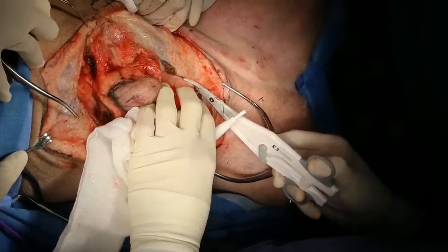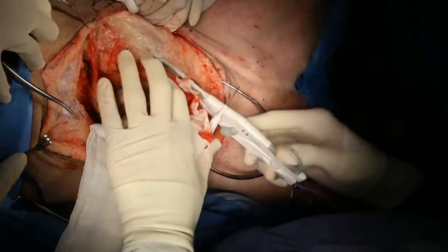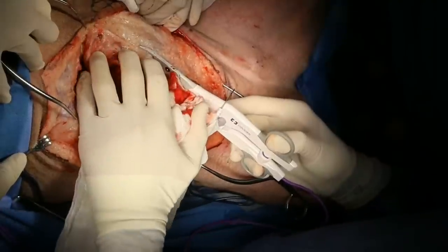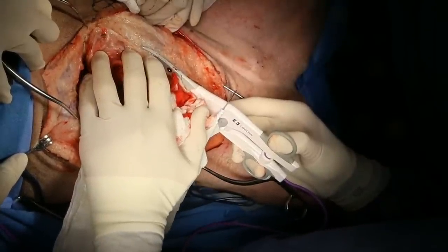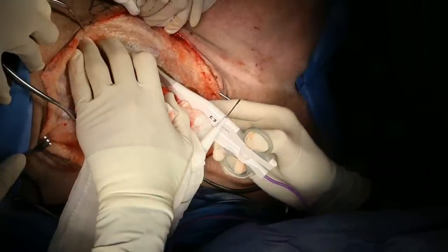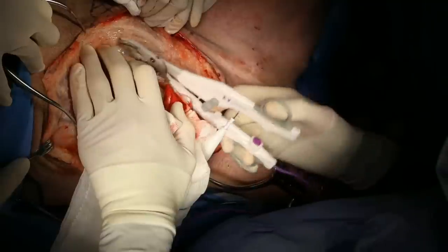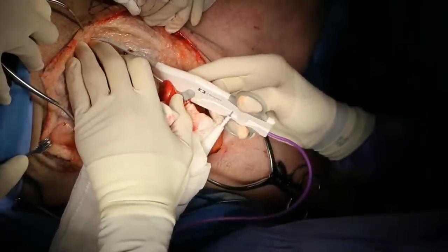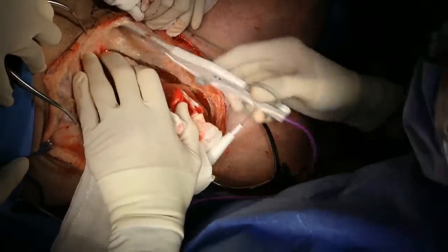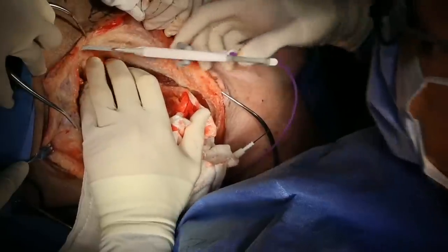I beg your pardon? Rosalie's asking about instruments we are using in this surgery. So mostly just Ligasure, which is a vessel sealing device. It's a bipolar device that seals vessels up to about 7 millimeters in diameter and then cuts in between, although I would never trust it on a 7 millimeter vessel. I'm good for up to about probably 4 millimeters.